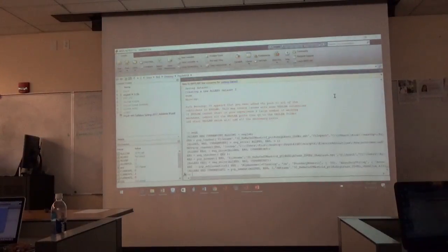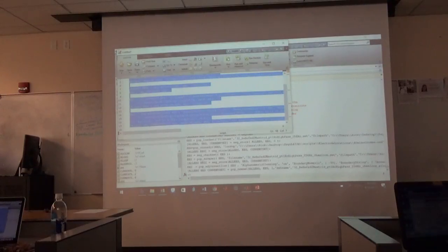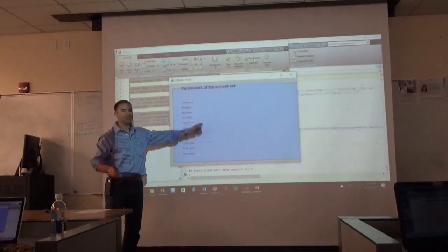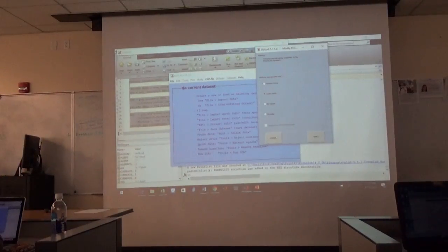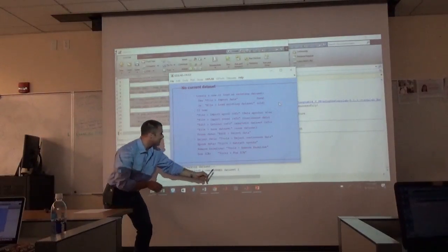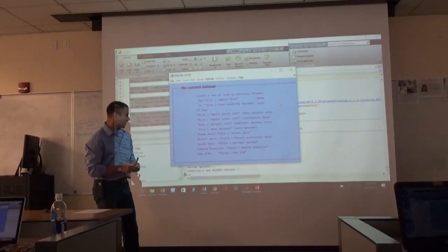Now let's see how that works. Highlight all this and hit run. So I ran the section. Now it's opening up a new round of EEG. And all I did was type in those two different numbers and hit run, right? I got to the point of selecting the code, so I'll just select that real quick. Saving it down here, creating a new set. And it should be done in a second. Pretty cool, huh?